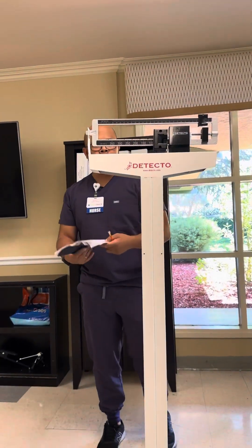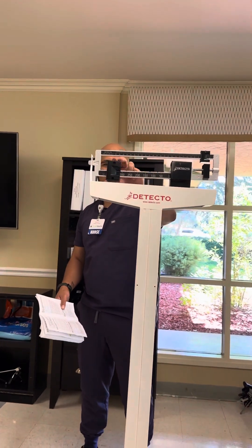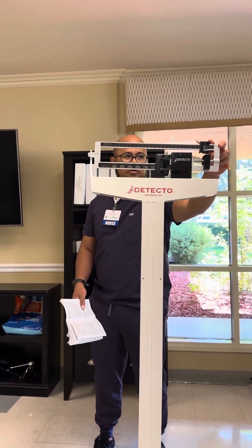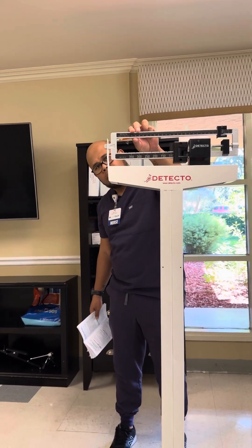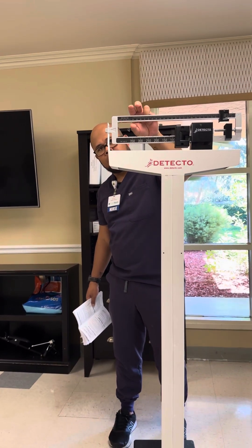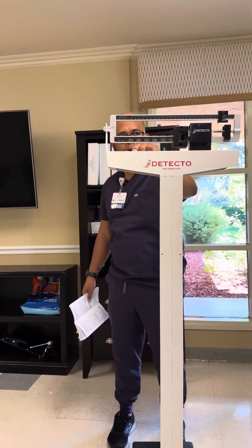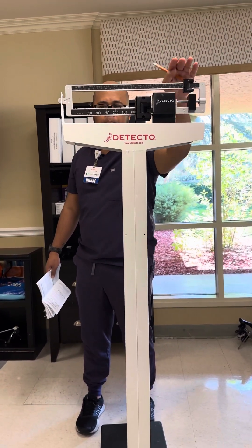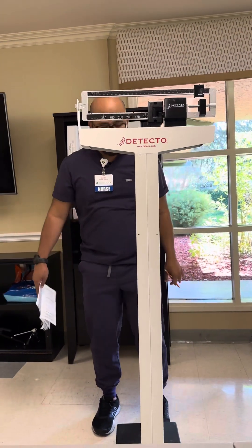Before you let the patient step on the scale, the book says make sure the patient has non-skid socks and non-skid shoes. Then calibrate the scale to zero — put everything to zero, all the way to zero. Make sure the measuring rod is not touching the metal; it should be in the middle.